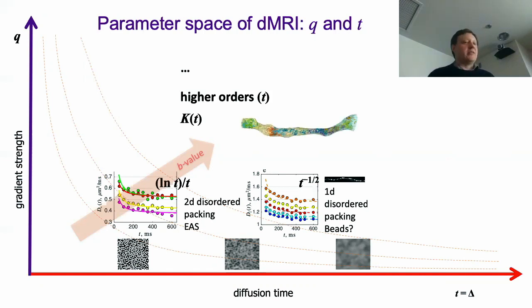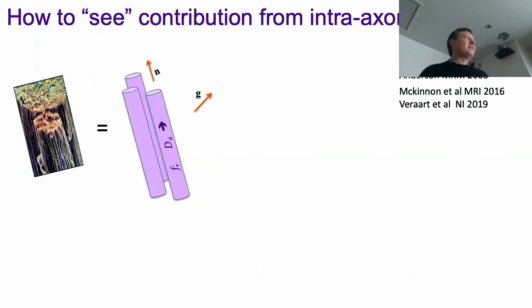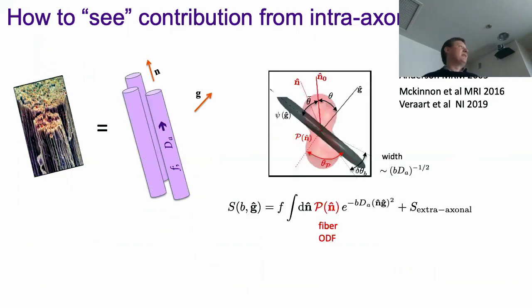But in principle, you can ask yourself, okay, so what happens when you go along the Q-axis? That's actually very non-trivial and interesting as well. It's actually very hard to do at short times at large Qs. So it's more natural to say at long times, when each compartment becomes almost Gaussian, let me just ramp up the diffusion weighting at sufficiently long times, maybe 100 milliseconds or so, and just think what happens there. And what happens there is a completely different physics, but it also gives you very interesting scaling laws. So I'll just mention briefly this result that actually goes back, if you read correctly, to the paper of Chris Kroenke, where it's already kind of there.